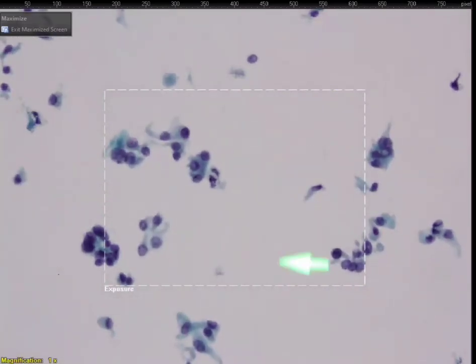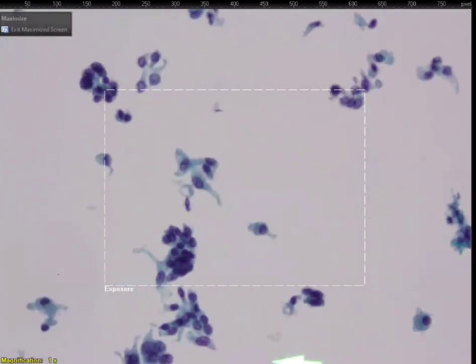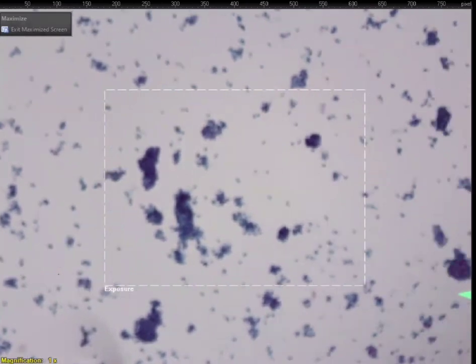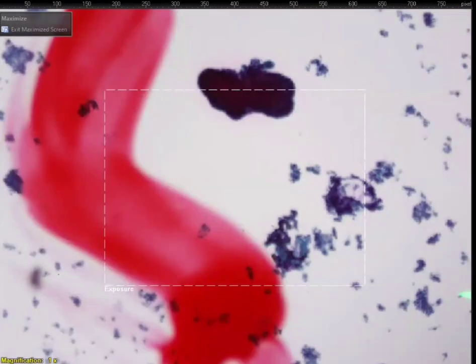This lymph node has that papillary feature and all other things to be confirmed as PTC, but there is an important point in diagnosing the lymph nodes which are near the thyroid gland, medial to the sternocleidomastoid, because thyroid gland parenchyma can be engulfed by normal lymph nodes, and sometimes we can see thyroid parenchyma in a lymph node.